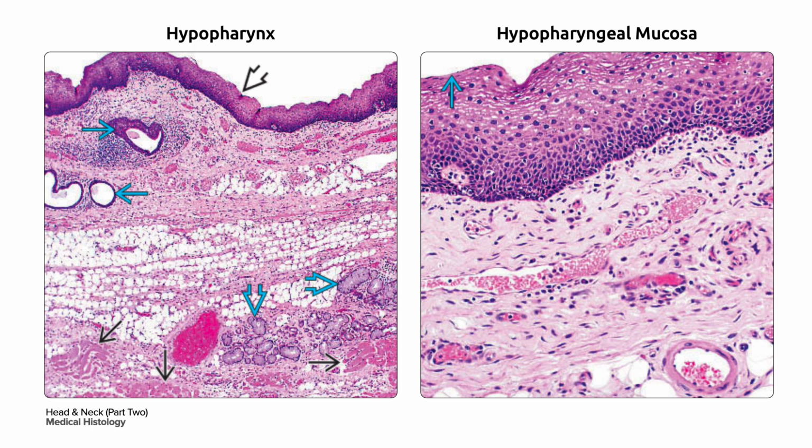On your left is the hypopharynx, similar to the oropharynx. It is lined by entirely non-keratinizing stratified squamous epithelium in bold black arrow. Scattered predominantly mucous minor salivary gland lobules are present in the submucosa with ducts in single blue arrow draining to the surface. Your pharyngeal constrictor skeletal muscle in a single black arrow is present below your submucosa.